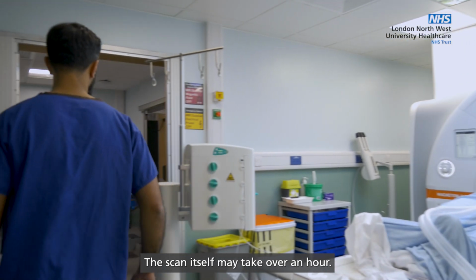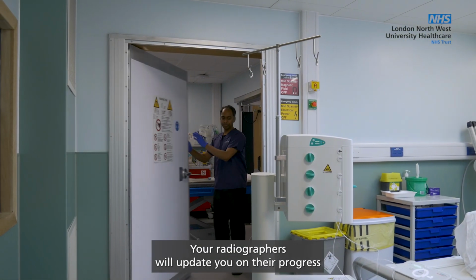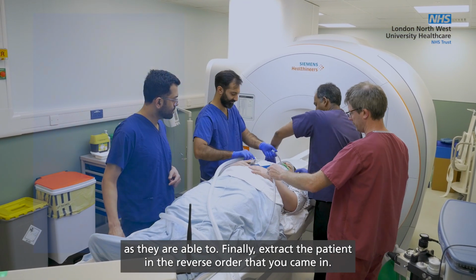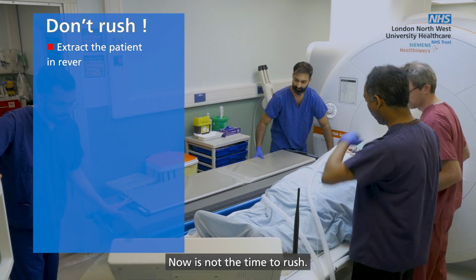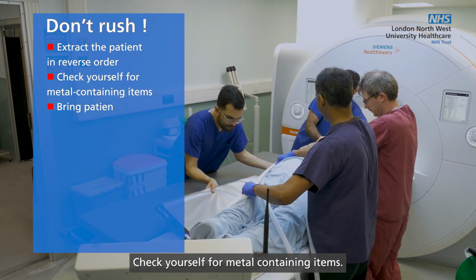The scan itself may take over an hour. Your radiographers will update you on their progress as able. Finally, extract the patient in the reverse order that you came in. Now is not the time to rush. Check yourself for metal containing items.